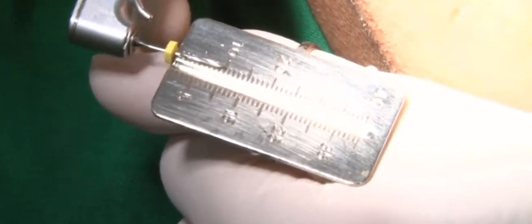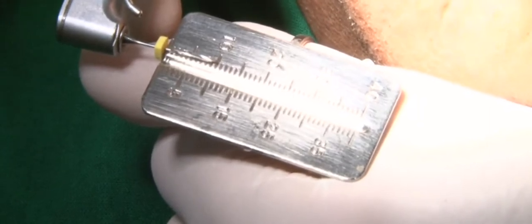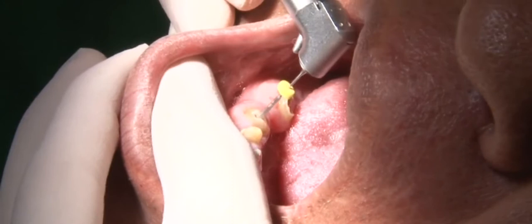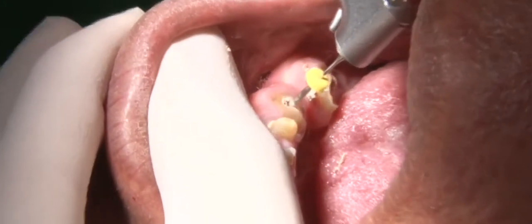The piezo number 1 is used first. The length required is measured with the help of a scale. This size of the piezo is narrower than the canal, so it follows the path of GP and does not engage dentin. Only remove part of the GP with this instrument. Do not apply undue pressure on the reamer.